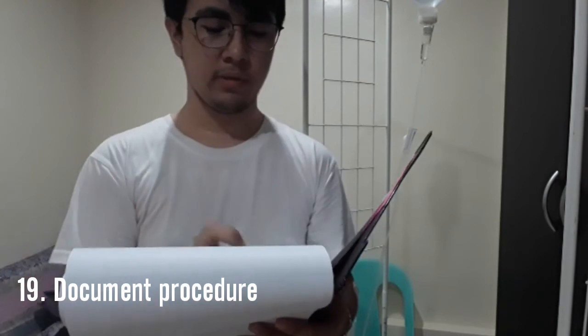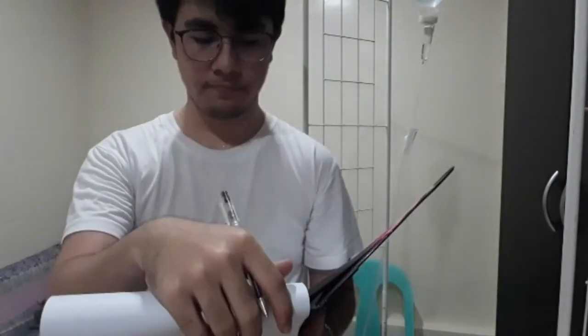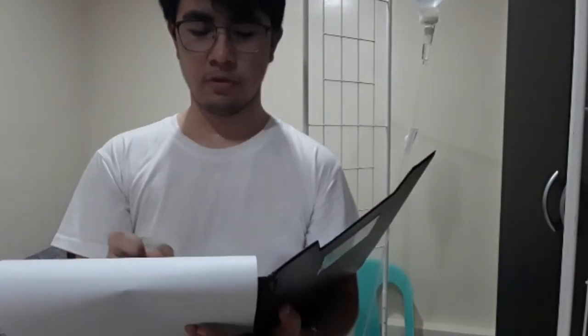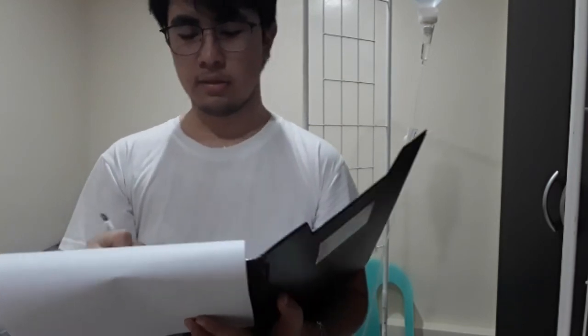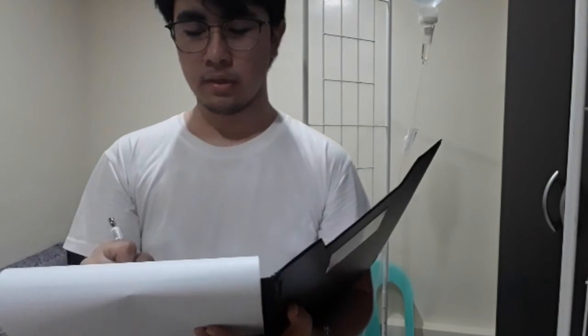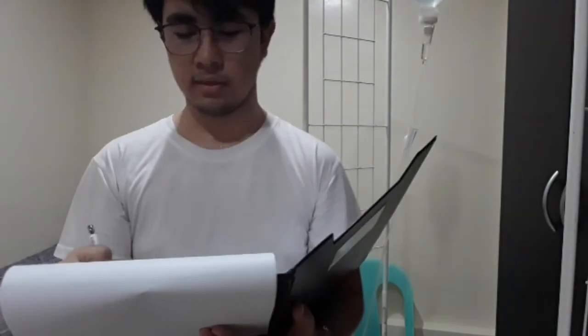So today is April 28, 2021, and it's 9 a.m. The type of solution is plain normal saline solution. Amount is 1 liter, and rate is 20 drops per minute. Started by Micro de la Cruz. Then no medication was infused, and so no medication added, so it's none. So this is the IV fluid record.